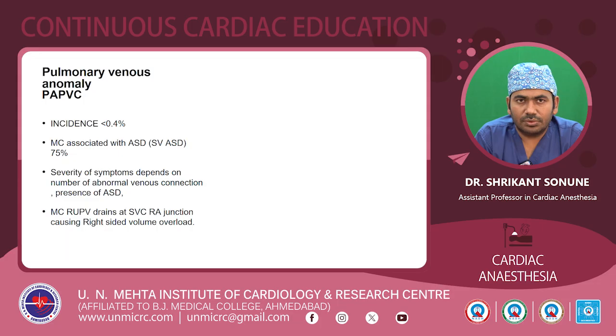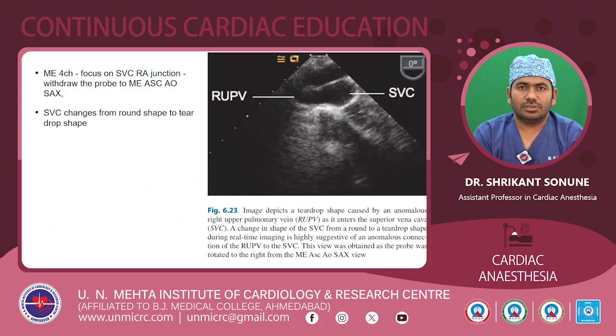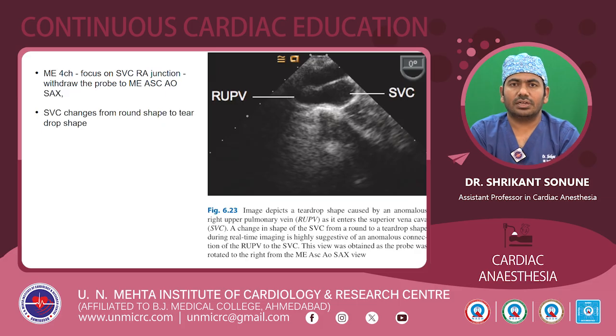The severity of symptoms depends on the number of abnormal venous connections and the presence of an atrial septal defect. Most commonly, the right upper pulmonic vein drains at the SVC to RA junction, which causes right-sided volume overload. There is an echo image depicting a teardrop shape, which is caused by the anomalous right upper pulmonic vein as it enters the superior vena cava.